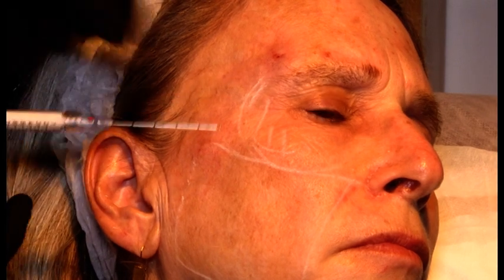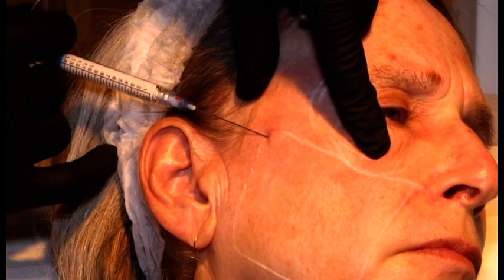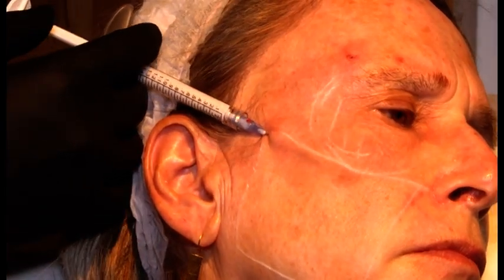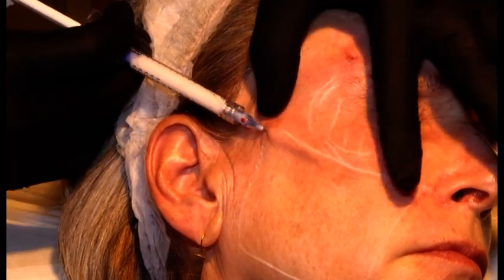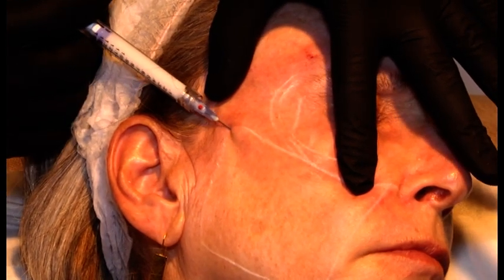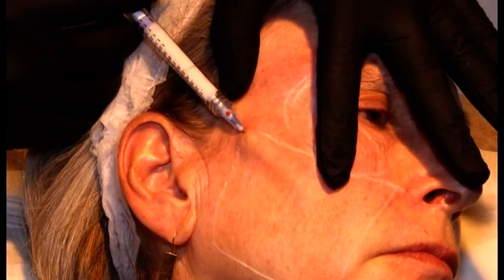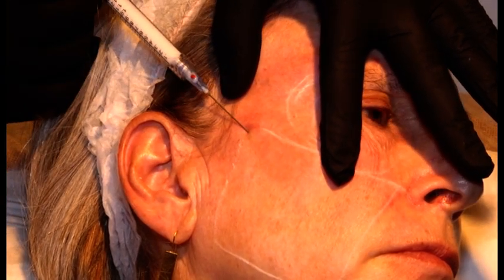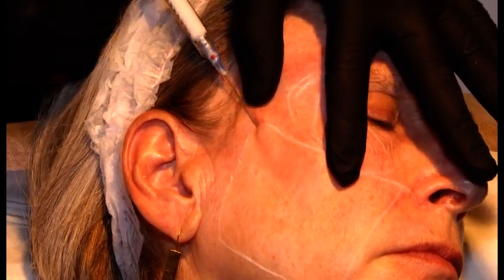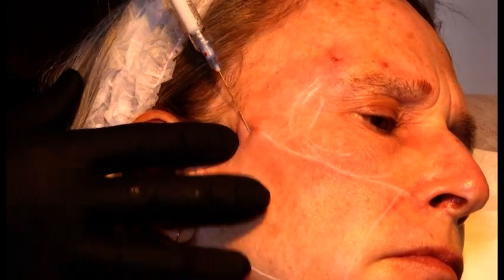Same cannula, same entry point, and now I will stretch the skin, advance the cannula underneath the skin, and I put the bevel up. There's a little bit of air in this syringe, guys, girls. You see when I do this, it's a little bit compressible. Normally, I really take care not to include any air into my syringe because it makes the product spongy.